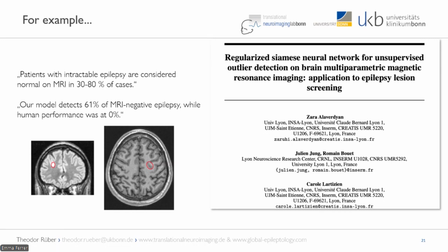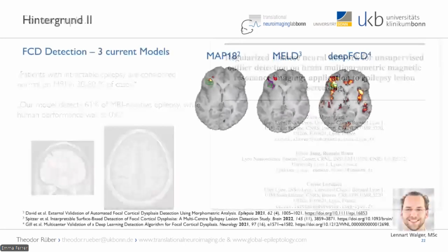Of course, I don't want to blame them. I just want to show that before you try to show the diagnostic superiority of any modality, maybe 7T, 3T, or any algorithm, you first have to define the baseline, and that's not really what has happened with regard to 3T or 7T, because we don't have the right metrics.